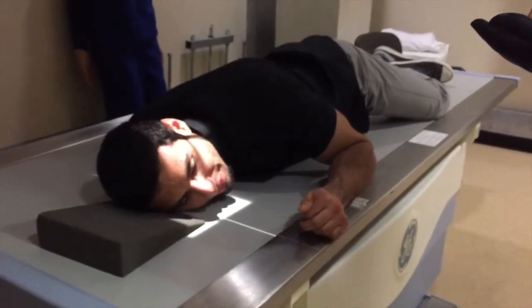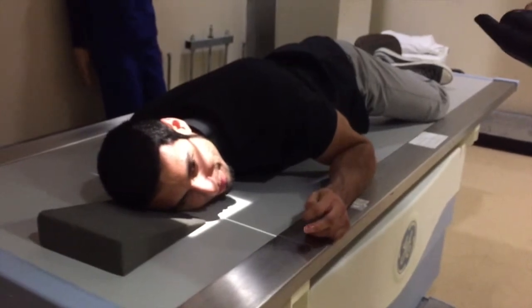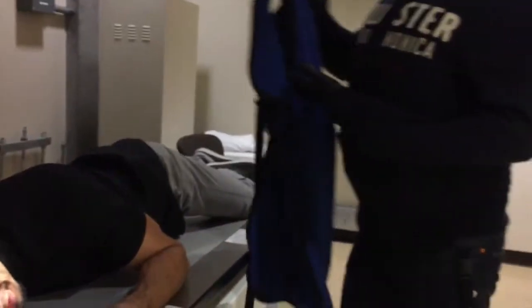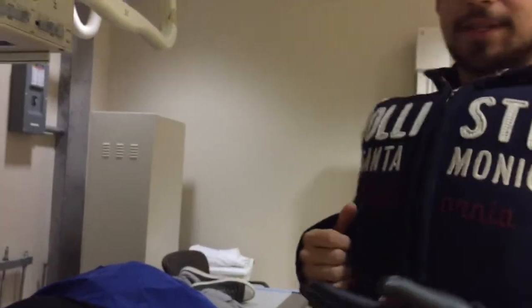So are there any radiation protection measures that we could take? Yeah, you're supposed to shield the patient. Let me go ahead and shield you. Ow! Shielding patients is for girls.